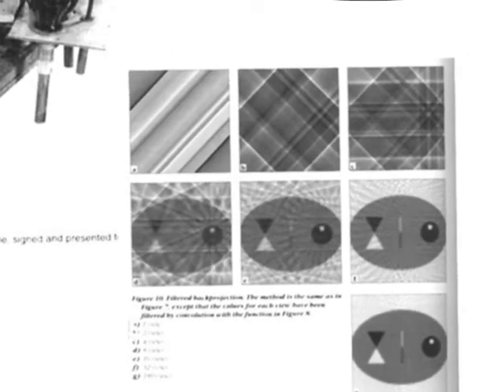So next term to probably write down on your slides is raw data. Raw data. And raw data is all of the thousands, maybe millions, maybe trillions of bits, right, that are produced when we take a cow brain and put it on a turntable and turn it around with a radioactive source and a detector, right? That's the raw data. It's just the junk, the weird looking stuff that comes out of that.